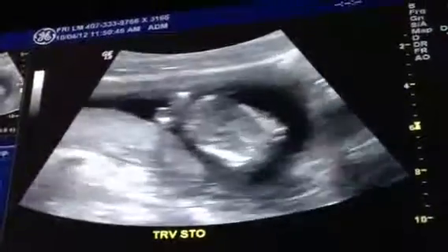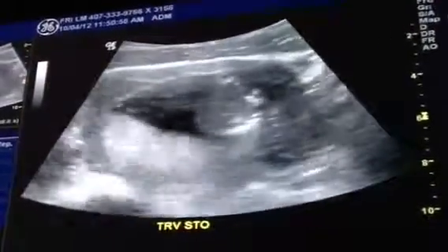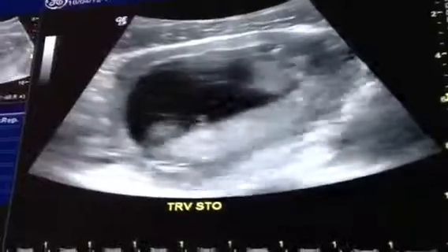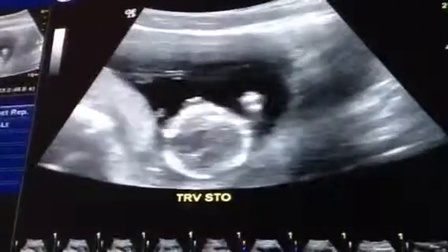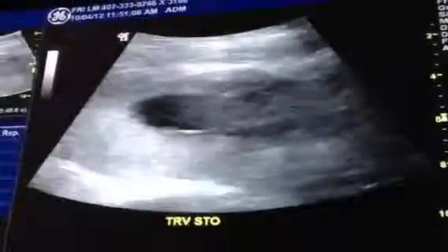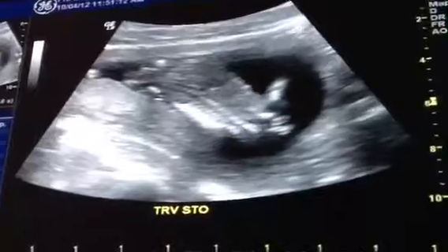Is this your first ultrasound? Yeah, it is. It's kind of a good view of the pelvis there. Alright, let's try to get the spine.